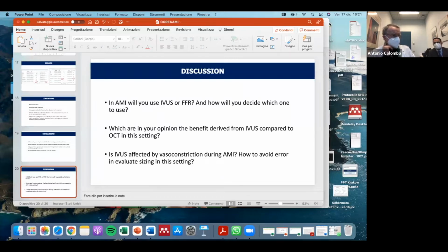We are aware that in left main, etc., but in my experience, with aggressive post-dilatation in acute MI, you can have more distal embolization, and I personally will be selective in using IVUS in ST elevation MI.